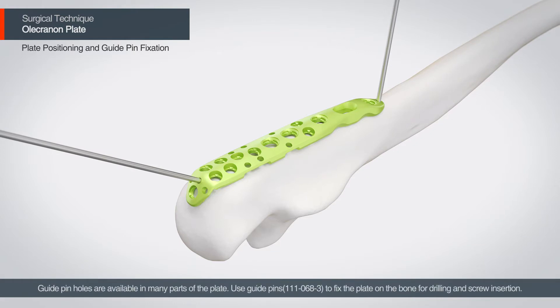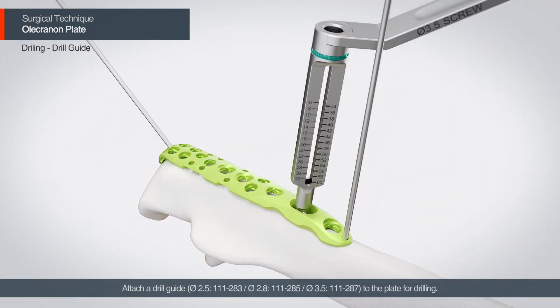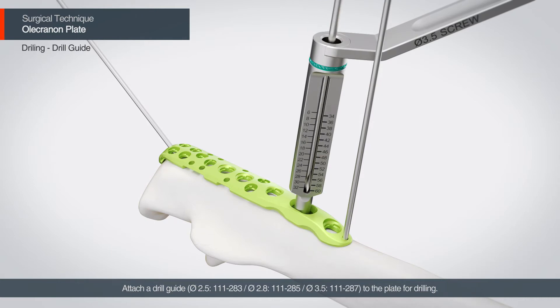The guide pin holes are available in many parts of the plate. Use the guide pins to fix the plate on the bone for drilling and screw insertion. Attach a drill guide to the plate for drilling.